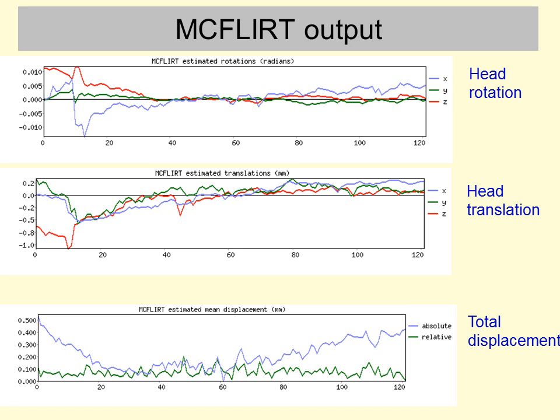So we can see the reference image would be the 60th one here, and we tend to see that the displacements relative to that are larger at the beginning and the end of the time series. That's not always going to be true, but it tends to be the case that the person is further away from where they were in the midpoint of the scan, when they're further away in time from that point.